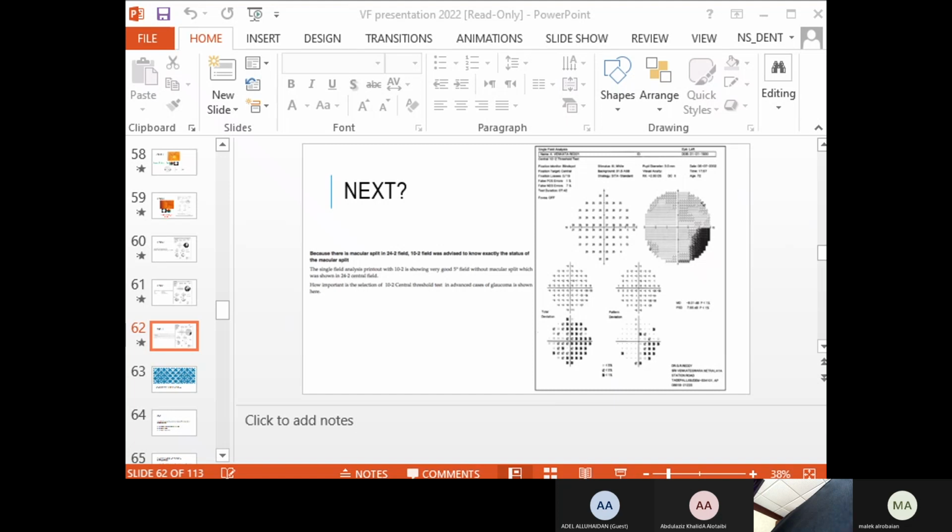Okay, this test has very high movement of the eye. See the gaze here, so you cannot rely on it, even if everything else is good. Another thing, refraction is not mentioned here. You should pay attention to everything. We repeat the test. This is normal. Refraction is corrected. All pass.